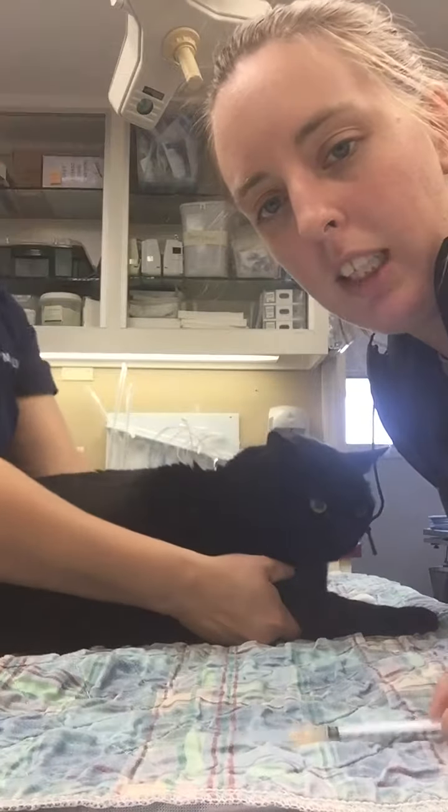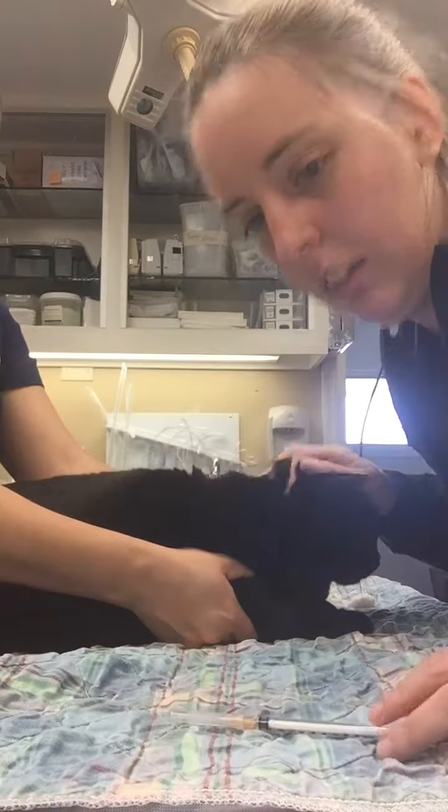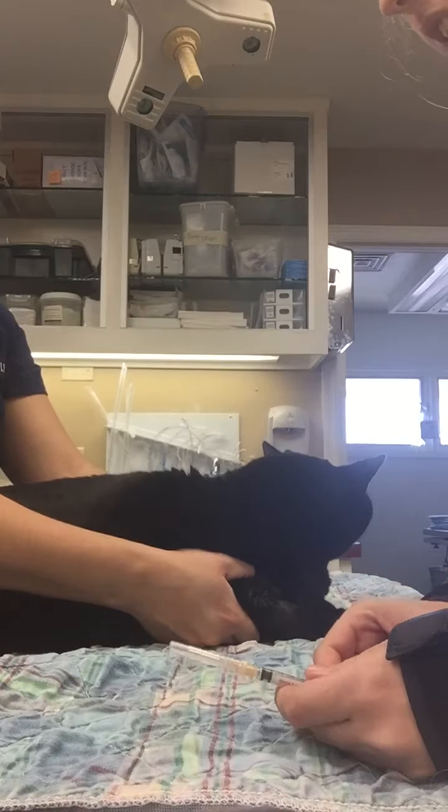Hi, this is Jenny Spencer and today I'm going to perform a cephalic venipuncture on my patient Bandit. I have got the appropriate instruments that I need. I have selected the appropriate size needle for him.